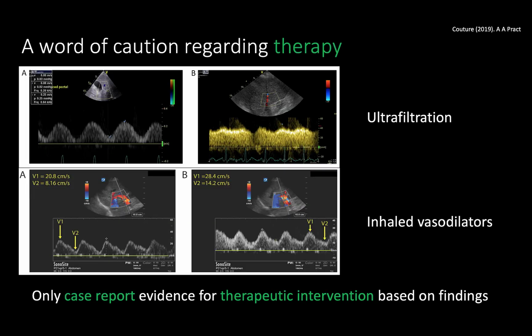An important limitation of using portal vein Doppler profiles for clinical assessment is that they do not provide information about the patient's position on the Frank-Starling curve. As such, abnormal findings do not necessarily mean that diuresis is warranted, as some pathologies, such as chronic pulmonary hypertension, are preload dependent. These may be better treated by pulmonary vasodilatation and inotropic support.